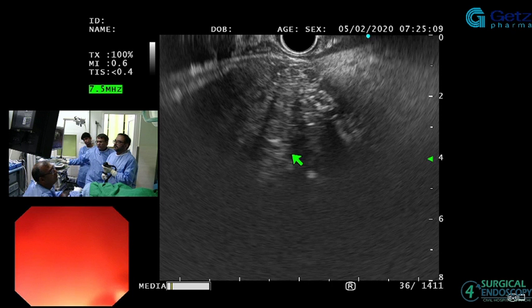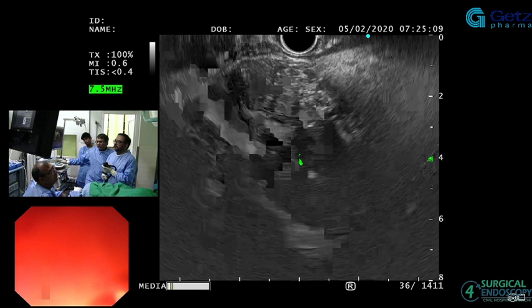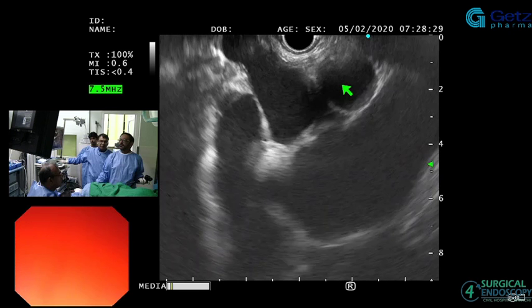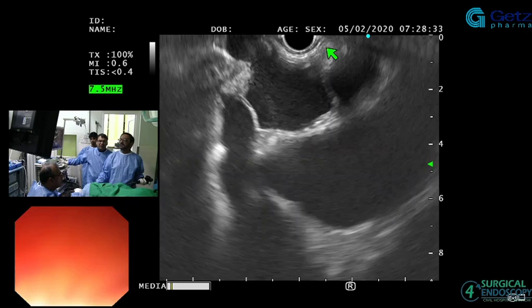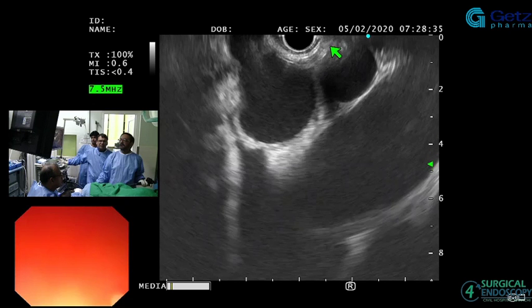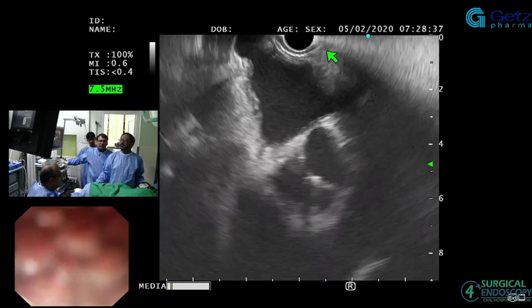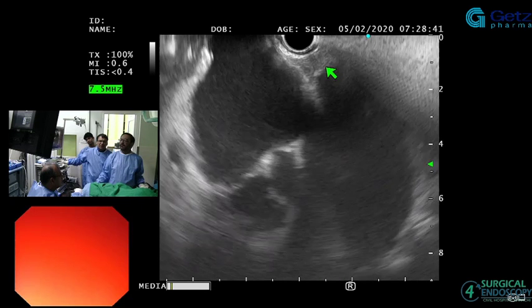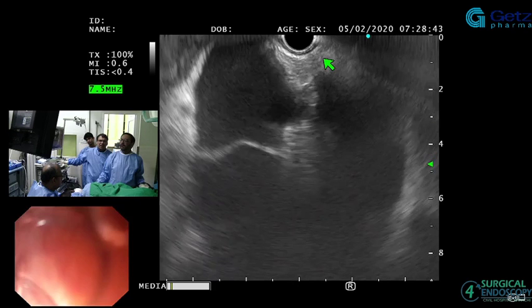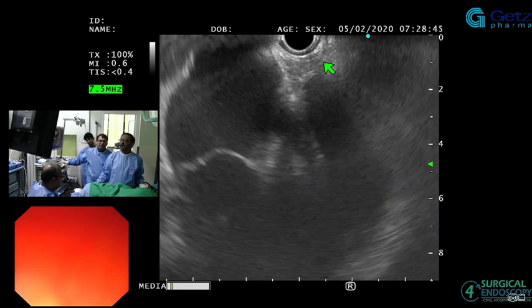Yeah, pulmonary artery, left atrium, aorta, and rotate a little bit to the left. Pull the scope back a little bit, big wheel towards you a little bit. Okay, pull the scope back. Now rotate a little bit to the right after this. So this is a better position.